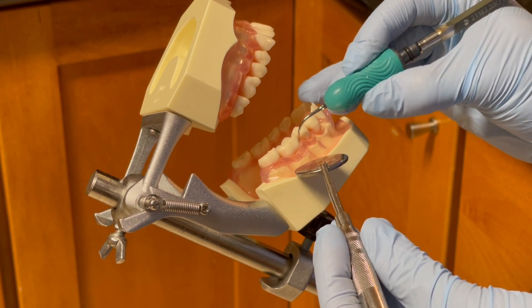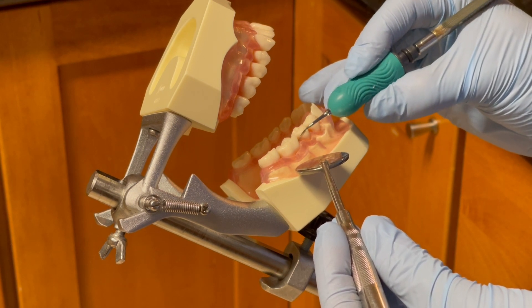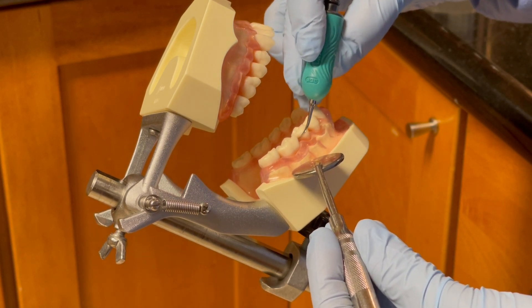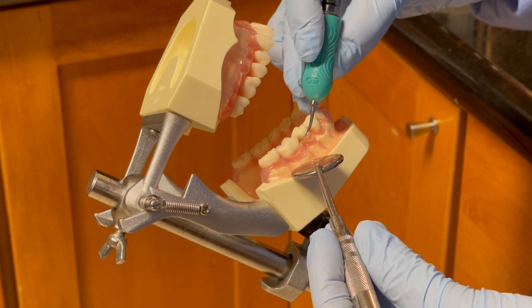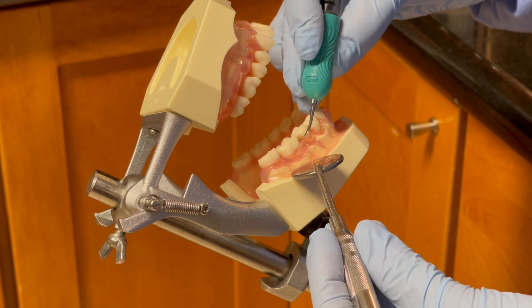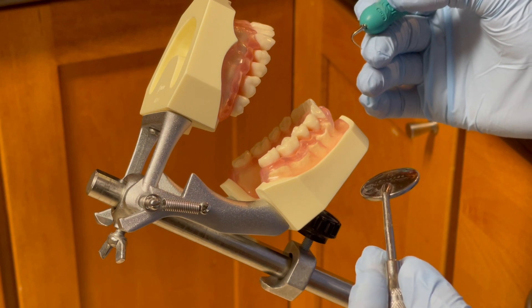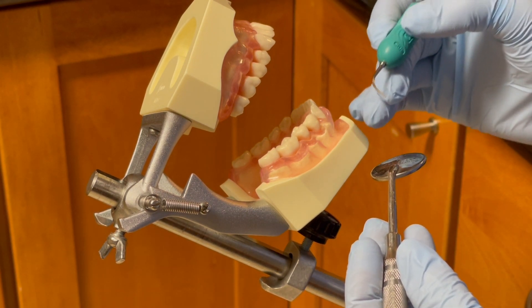When touching the contact area, I change to transverse orientation, use the side of the tip adapted to the tooth, use vertical strokes, and finish the mesial interproximal surface. I will do the same procedure for the buccal surface of number 29.